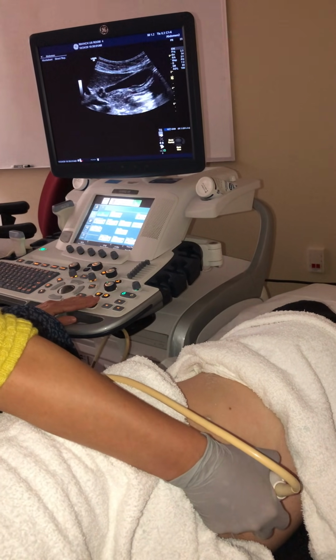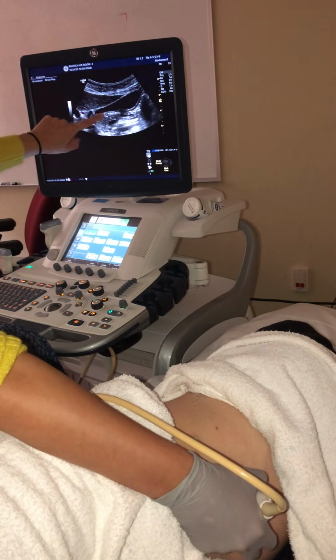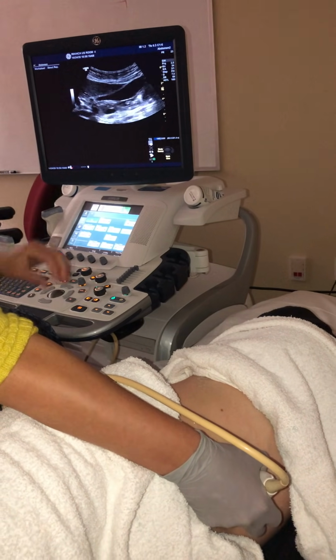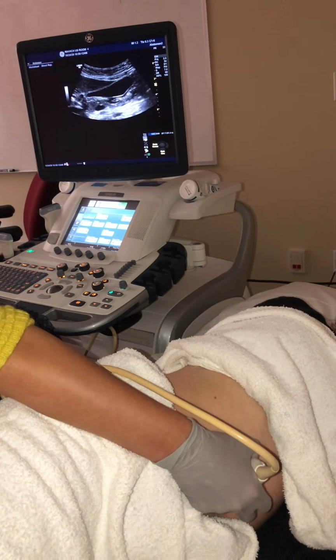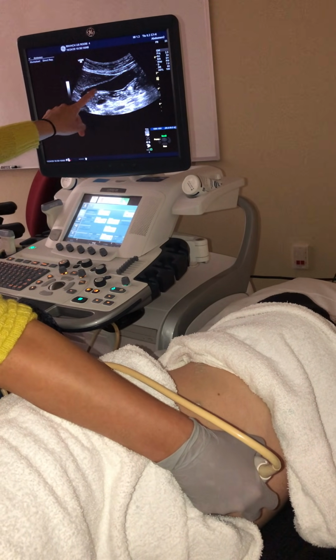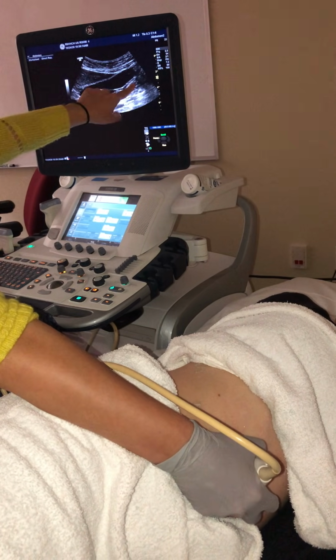So here we have our elongated sagittal gallbladder. It looks longer than it did in the supine position. That's because it's kind of stretching with this new position, and that's totally normal. You're going to see a little bit different shape when you have your patient move. So we have our neck down here. It's a really nice neck there. We have the body, and we have the fundus.